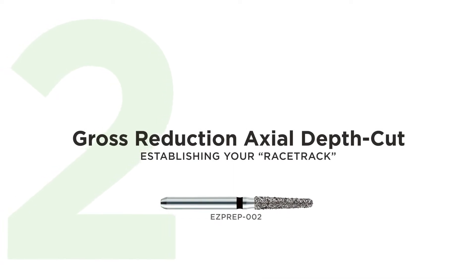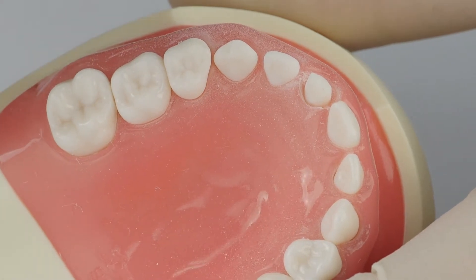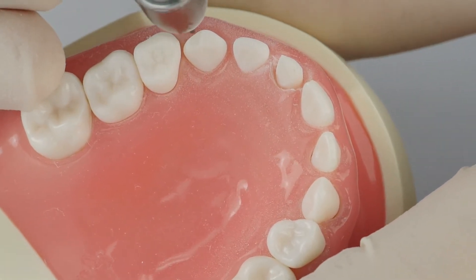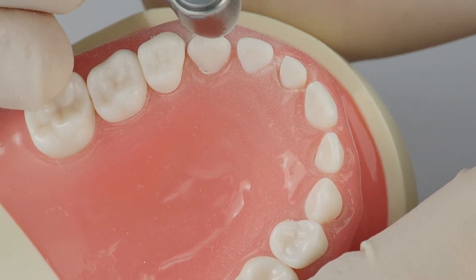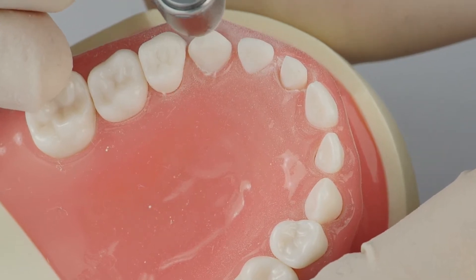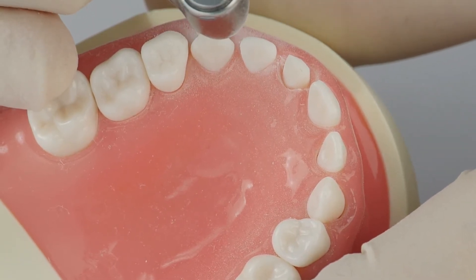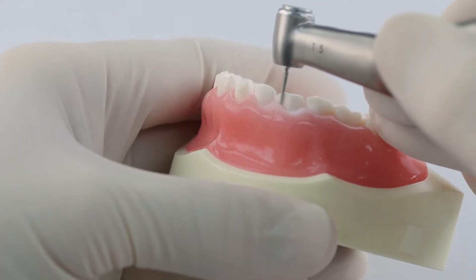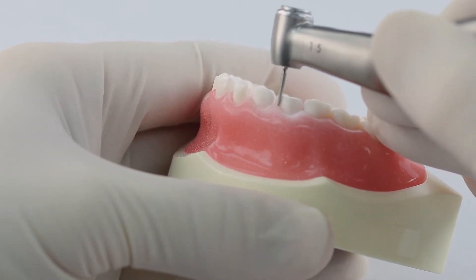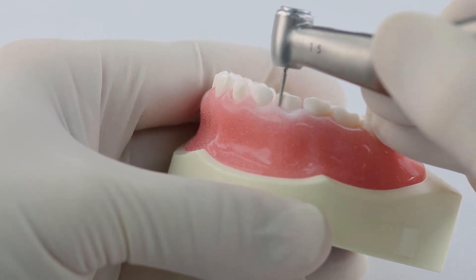Step number two, just like incisor preparation, you're going to do your gross reduction axial depth cut step, then the racetrack axial depth cut step. When I do my racetrack, it's almost like tracing — you make a faint little line right where you want it, which is right along the gum line. Then once you have it where you want it, you go back in and thicken the line to create your racetrack, making nice big sweeping movements to groove that racetrack.